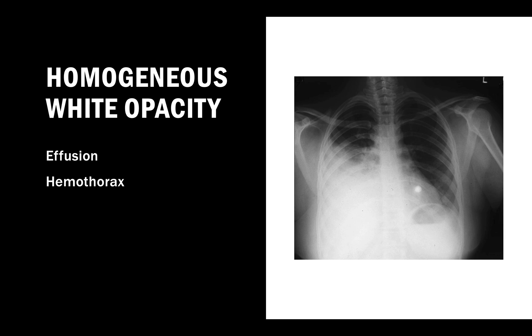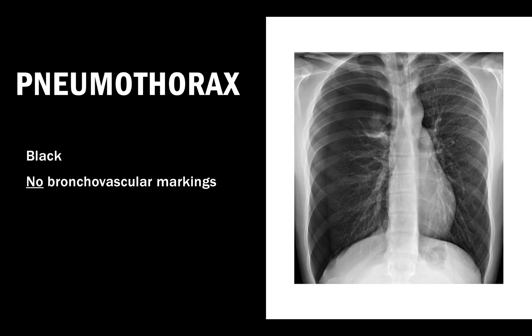Black bronchovascular markings not reaching the thoracic cage indicate pneumothorax. You can see the lung line here - beyond that line there are no bronchovascular markings. Sometimes you get confused by the line of the scapula - don't. If you see bronchovascular markings and a line, that's not pneumothorax. Pneumothorax is completely black with no bronchovascular markings.